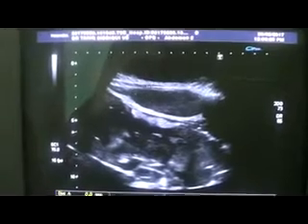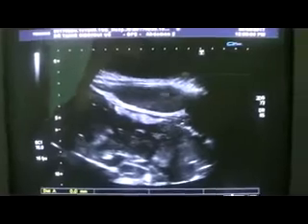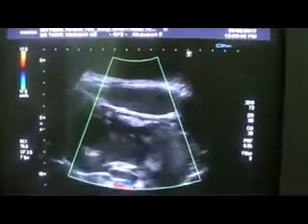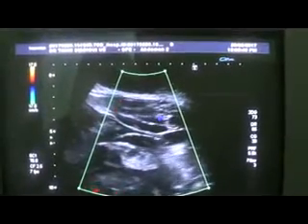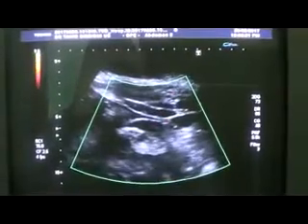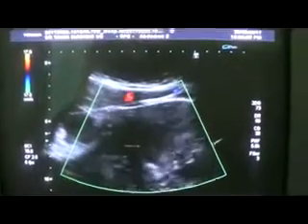You see the septum. This is a fluid-filled area — echo-filled area. These are all echoes. These are calcifications, tiny. None of the septa show blood supply within. No vascularity is seen within.